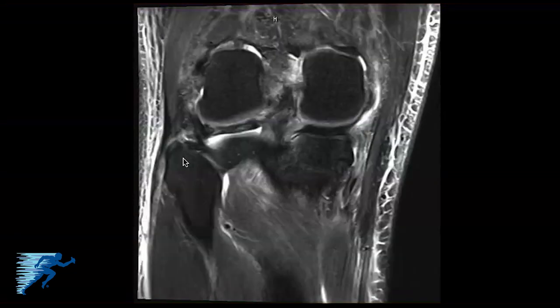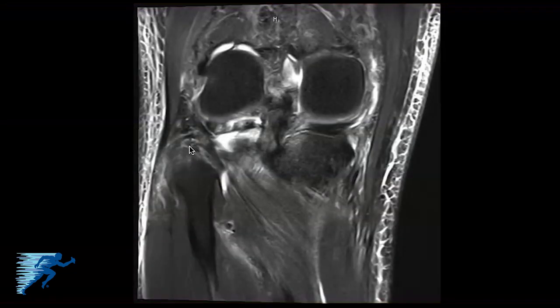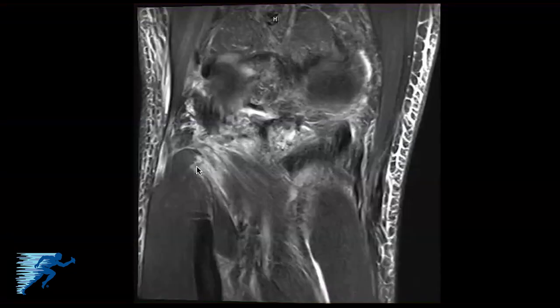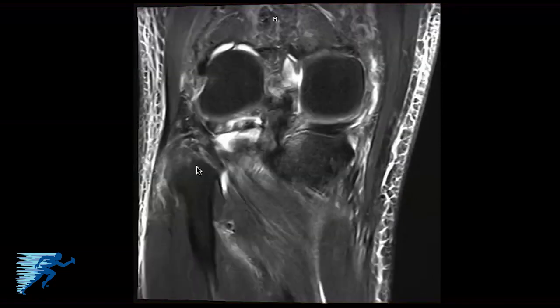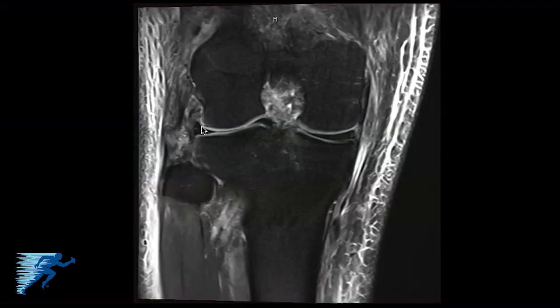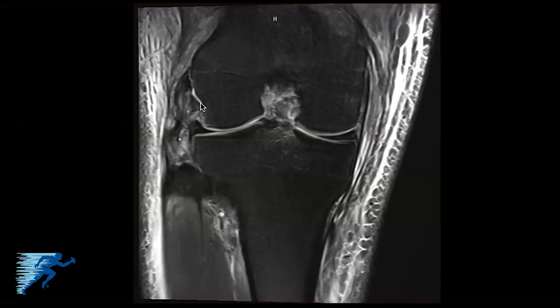Concurrent with this, we can see some signal change and disruption of the popliteal fibular ligament. The popliteal fibular ligament courses from the posterior medial aspect of the fibular styloid up to the musculotendinous junction of the popliteus. As we follow that back out anteriorly, we can see that there's been a disruption of the popliteus tendon at its attachment site on the femur.